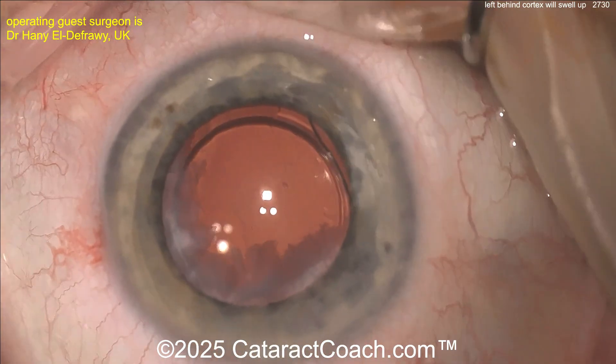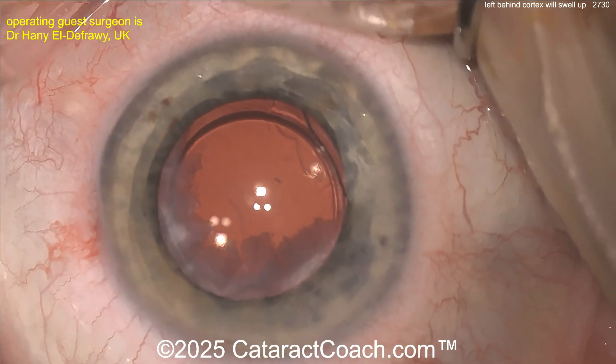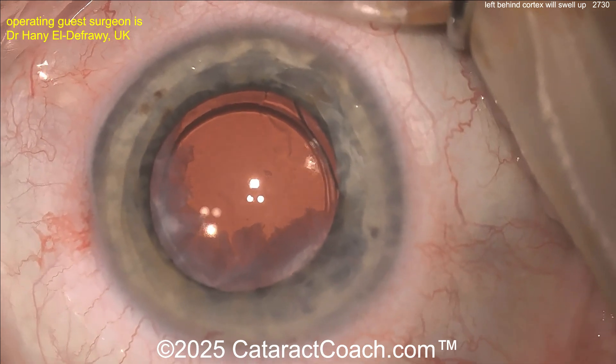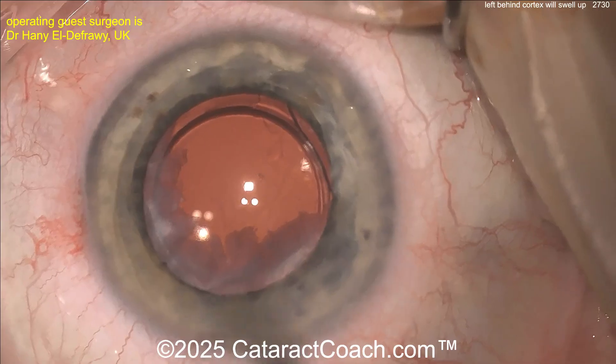You want the IA probe to get all that lens material out and then the patient is going to be happy. Don't think the inflammatory cascades are going to help dissolve it — over the course of what, a year? How much do you want the patient to suffer? Just go back in the eye and remove it. I know everyone hates to go back to the operating room, but if you need to, you need to.